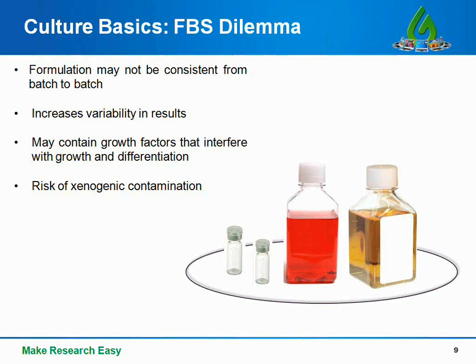Now when collecting and isolating CD34 positive cells, several protocols will use IMDM media with 10% FBS. However, many of these protocols switch to a serum-free system when expanding and differentiating HSCs. The reason for this is that the composition of FBS may not always be exactly the same from batch to batch. Even small differences in growth factor composition can cause variability in experimental results. Also, FBS may contain growth factors that impede stem cell growth, such as TGF-beta. Finally, there is a risk of xenogenic contamination if culturing human stem cells in the presence of FBS.